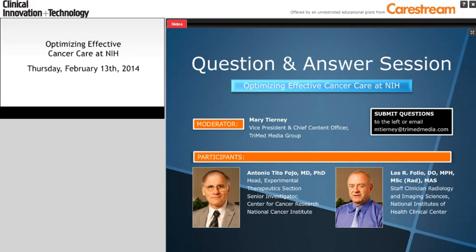And that's fine. Okay, I want to know about everything in the patient, but I also wanted to know about some lesions and how it's progressing along, and especially if you're altering the therapy, if you've altered the dose, if you've changed courses in your therapy. You don't want to now be looking at 2 different lesions than you were before and knowing what's happening there as opposed to what you knew before.